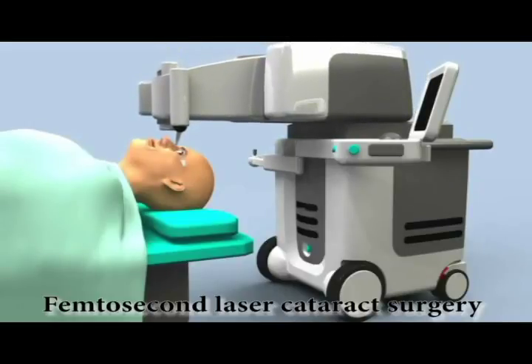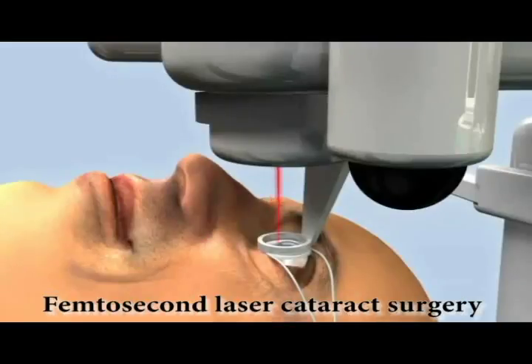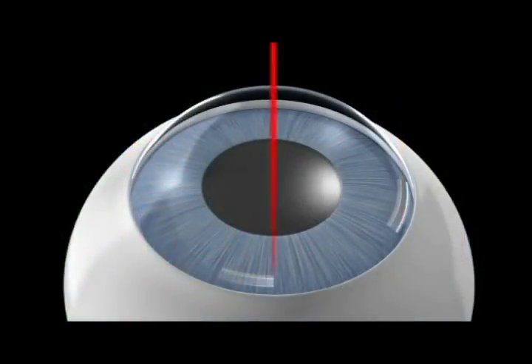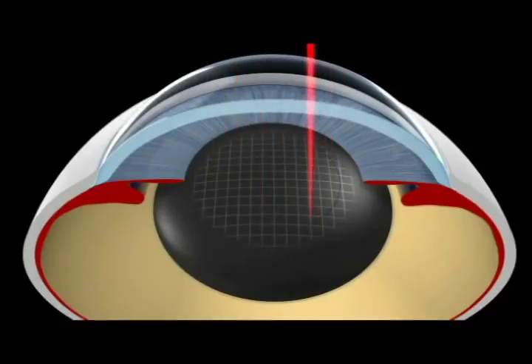Their evaluation has begun. At present, there are several devices that use femtosecond laser technology in cataract surgery. With the help of these devices, we can replace all manual steps with laser. Femtosecond laser can produce a customizable, clear corneal incision with any preferred architecture. Capsulorhexis can be done with any preferred shape and size specified by the surgeon to ideally suit individual intraocular anatomy and the selected intraocular lens.